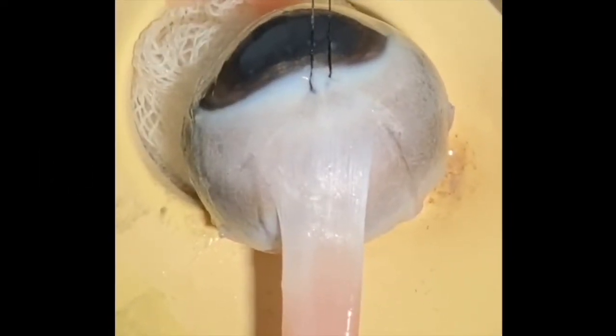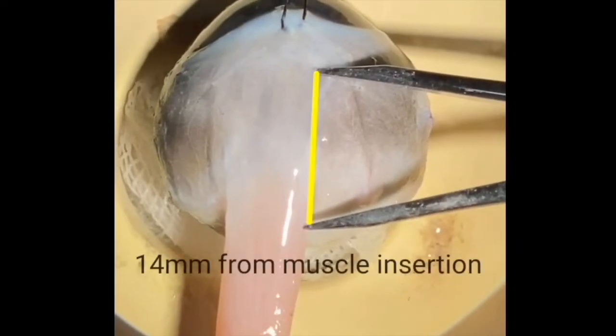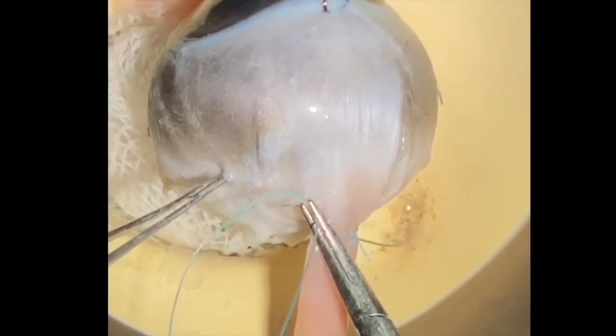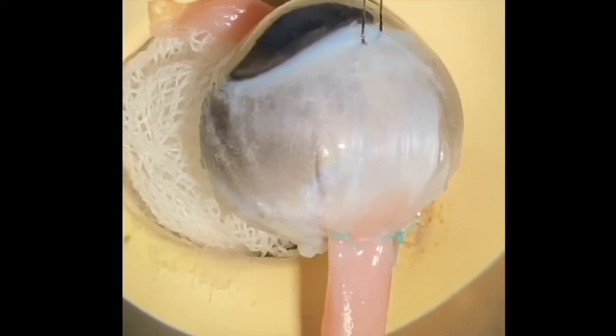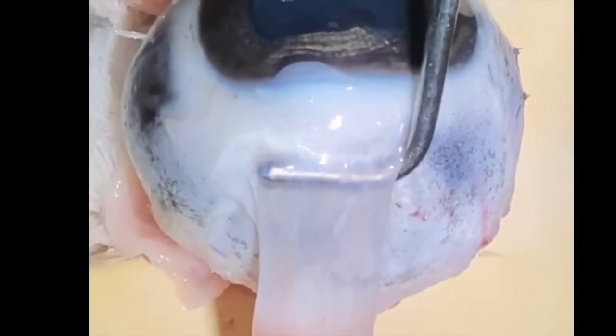Now we will be demonstrating procedures on recti muscle. To simulate Fadden surgery, a rectus muscle is identified and hooked. Marks are then taken at 14 mm from insertion site on both ends of the muscle. It is then secured to the underlying sclera using 5-0 ethibond suture at its either ends to complete retroequatorial myopexy of Fadden. This is a vertical view depicting completed Fadden's procedure.